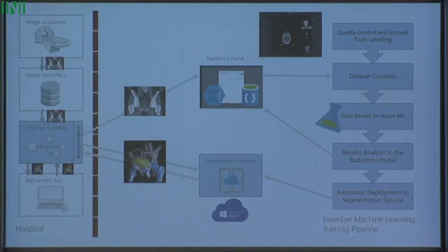For instance, hospitals. It always starts by installing what we call an InnerEye gateway. This gateway connects the hospital to our platform. It also allows the hospital to upload images based on patient consent, and to evaluate the quality of the models.